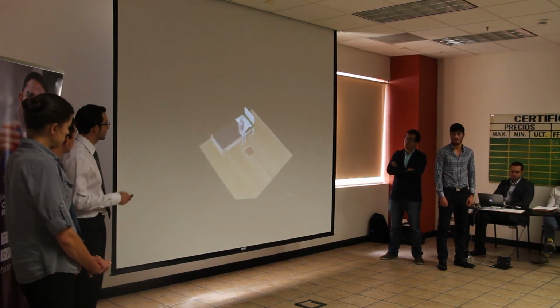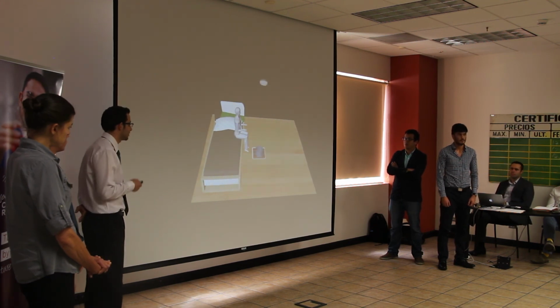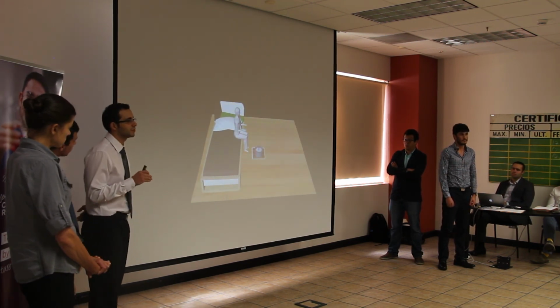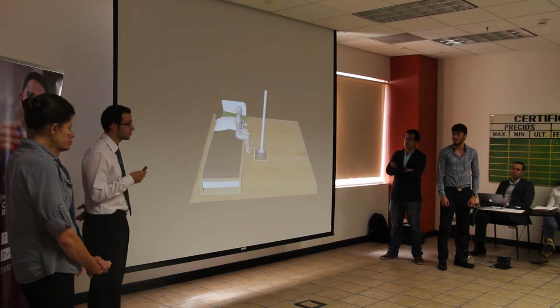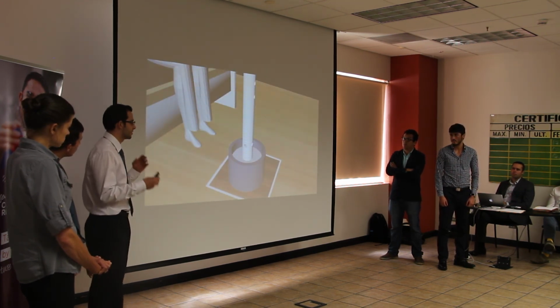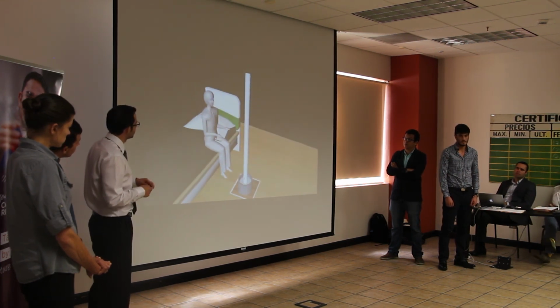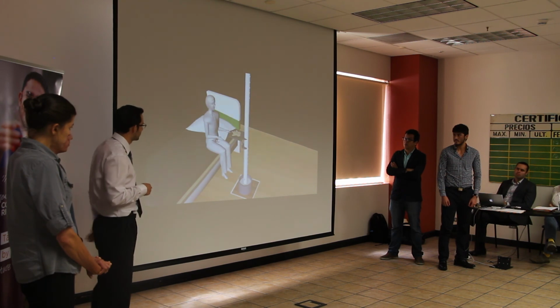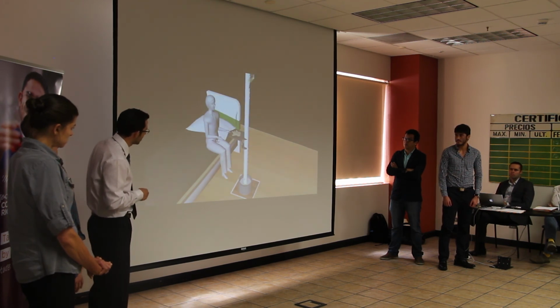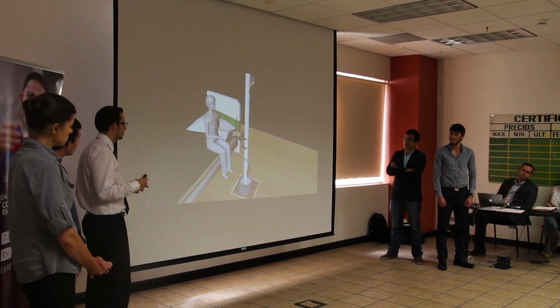As you can see, this is going to be our device. It has 4 main pieces: a base with a hollow, so the patient can use sand, soil, or another material to add stability. We have a table with an additional mount, so that we can minimize the risk of the table falling off.